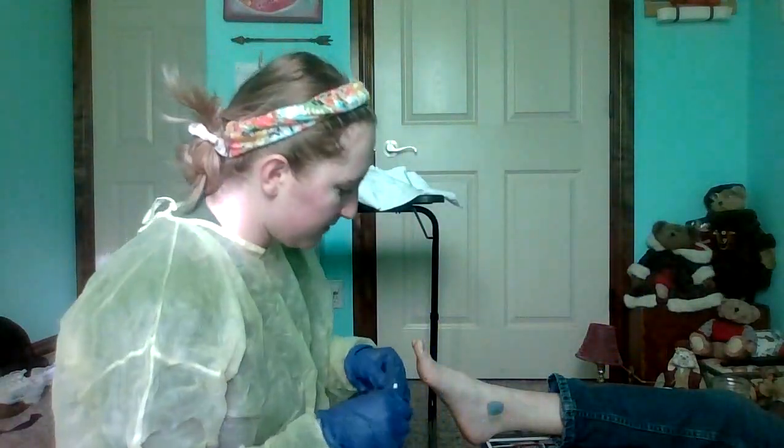So first off, we'll go ahead and measure the wound. You're going to measure it with a couple of things. Right now I have the Q-tip and then this nice little measuring chart. You can measure it with a tape measure or anything that you can really lengthen it with. So you measure with length, width, and depth. So length is from top to bottom. And this is a pretty nice circular wound.